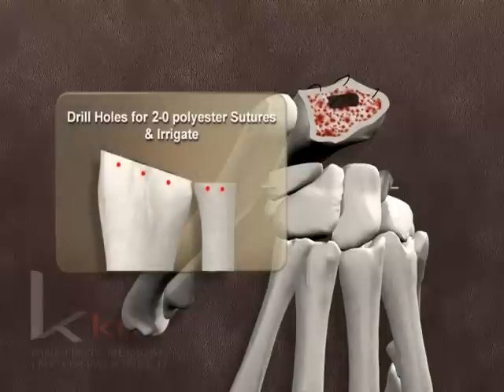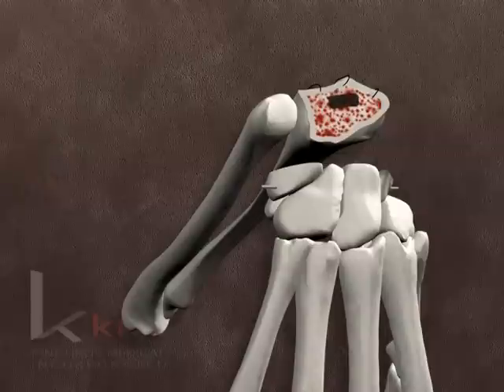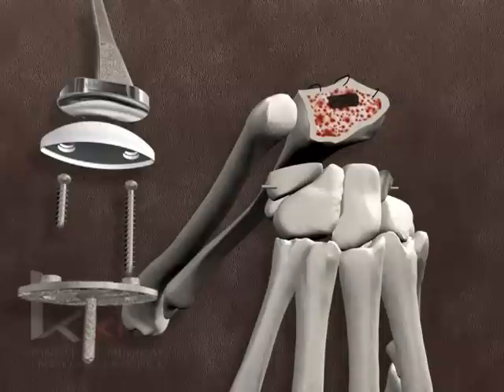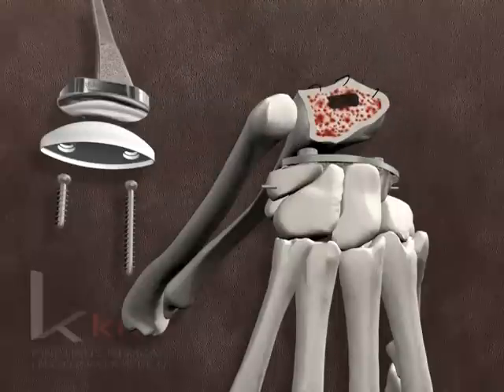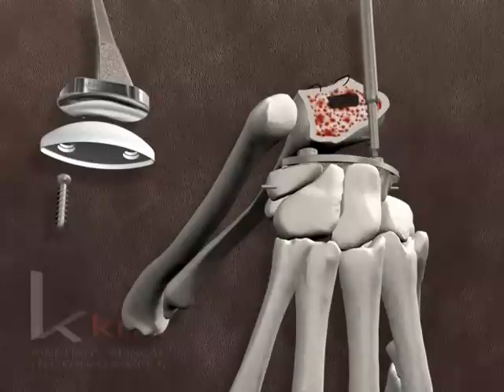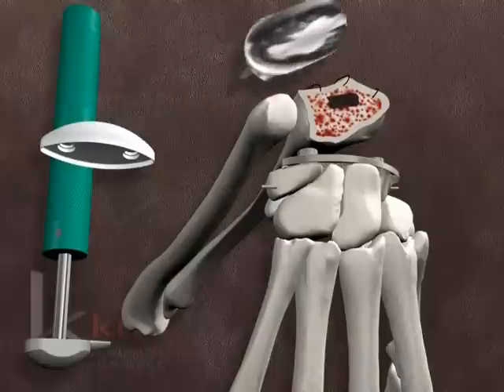Three sutures of 2-O polyester are placed through small bone holes along the dorsal rim of the distal radius and ulna for later capsule closure. When indicated by the surgeon, bone cement is prepared in the usual manner and injected into the cavities for the carpal and radial component stems just prior to final implantation. Using the carpal plate impactor, the stem of the actual carpal component is driven into the capitate hole. The true radial and ulnar 4.5 mm screws are inserted and tightened firmly. Remaining K-wires from the carpal are removed.